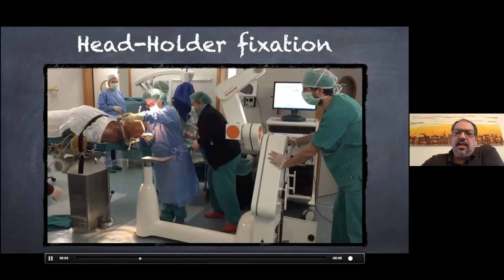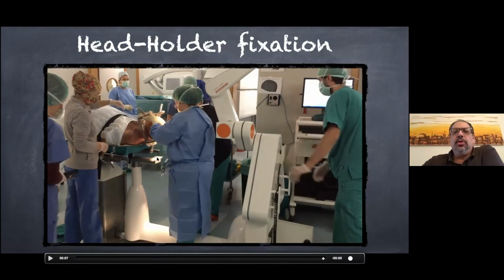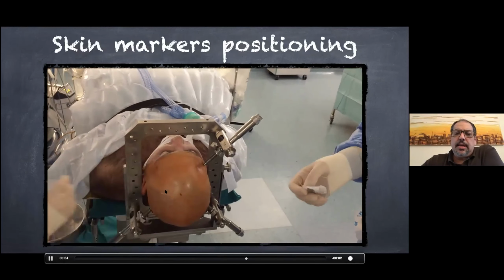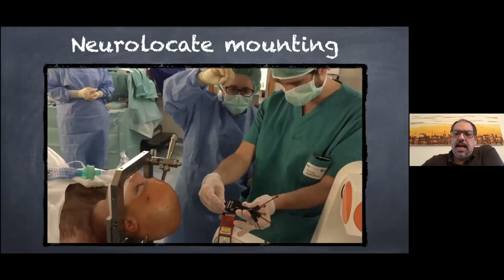Then, because the stereotactic space is the robotic space, we fix the head holder to the robot. Once everything is fixed, we put some skin fiducials. You see, we put some of them. We will see why in a few slides. Then we have to register the patient. What does it mean to register the patient? It means that at the end of the workflow, the planning space must be aligned to the robotic space with the head inside the robotic space.